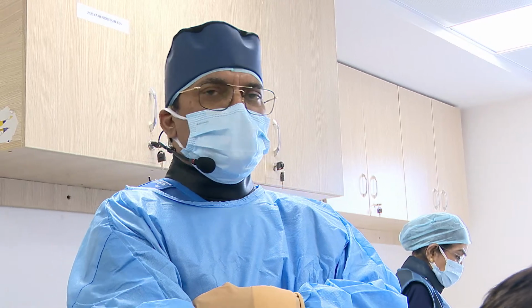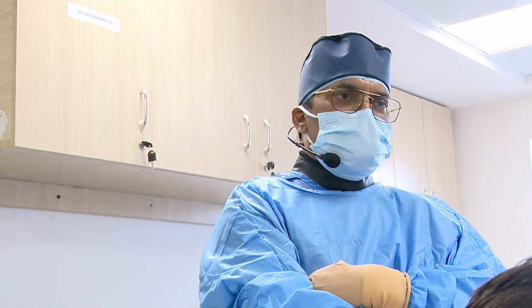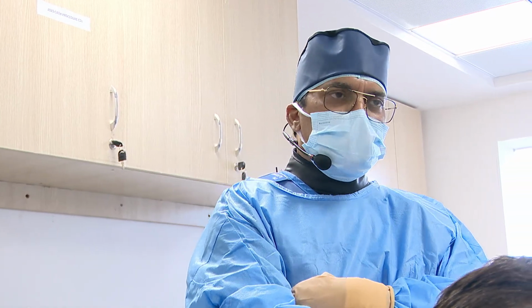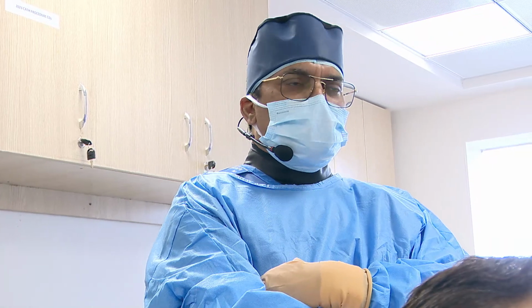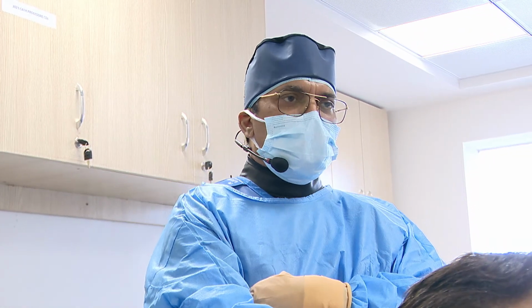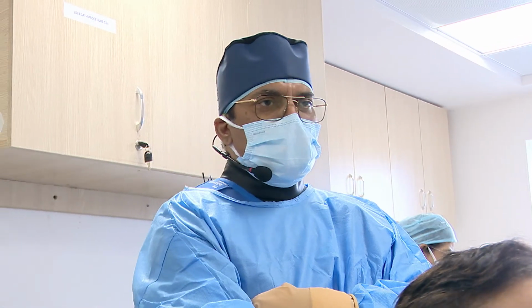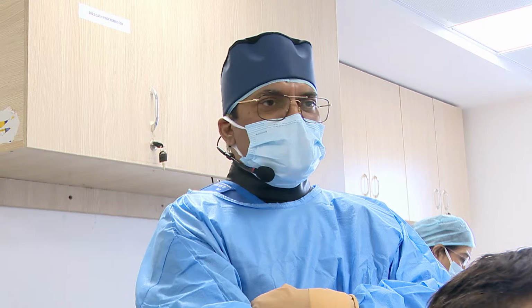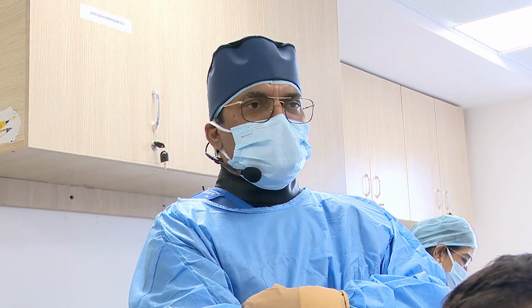So right now, as per the schedule, we wanted to show one LAD mid lesion involving the bifurcation. There is a very short segment lesion of the diagonal, hardly less than 5 mm. Though the lesion is there, it is less than 5 mm. And the important thing is 3 diagonals are there: diagonal 1, 2, 3.